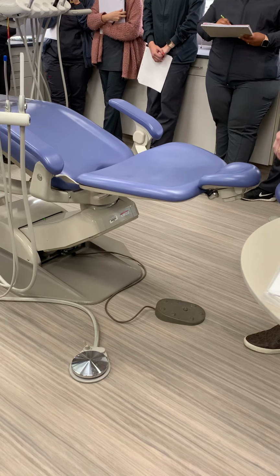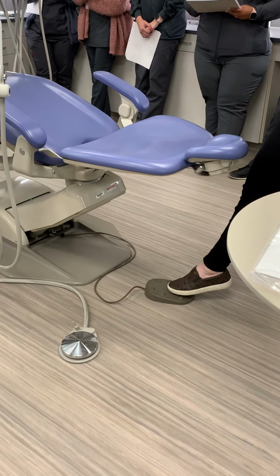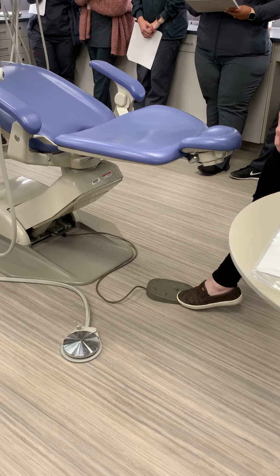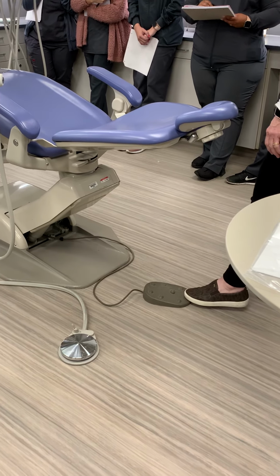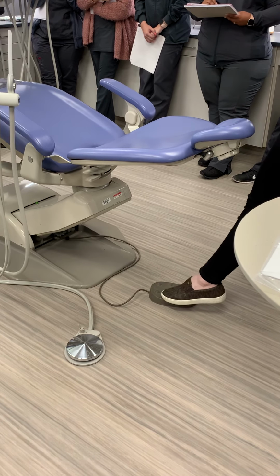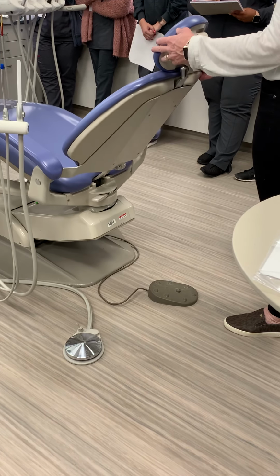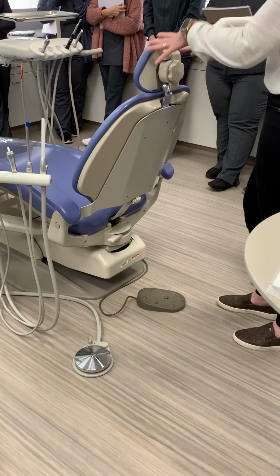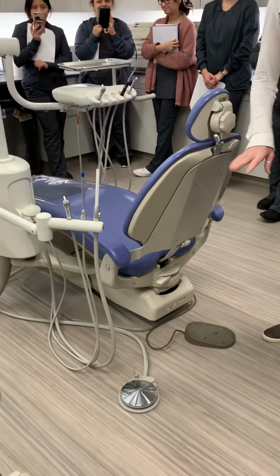And then if we just needed to lift the body of the chair, it's the arrow that's going forward. If we need to just adjust the backrest of the chair, it's the arrows on the side. So this one is down, this one is up. And if we need to lower the body, it's the one closest to your foot. Okay, to release our patient, we push 0 or stop. So you guys should seat each other in these chairs and practice that. You don't want to send your patient on a Disneyland ride, okay? They didn't pay for that.